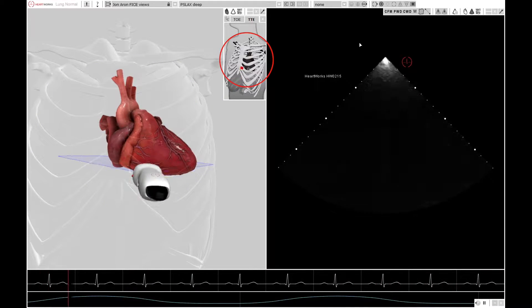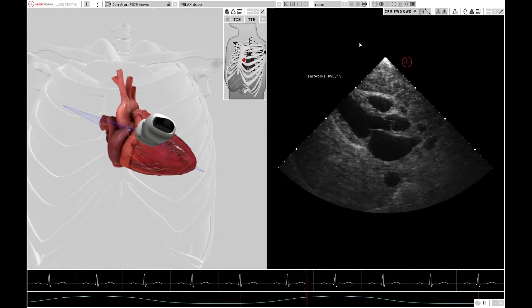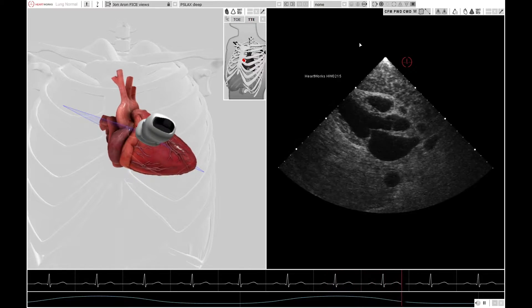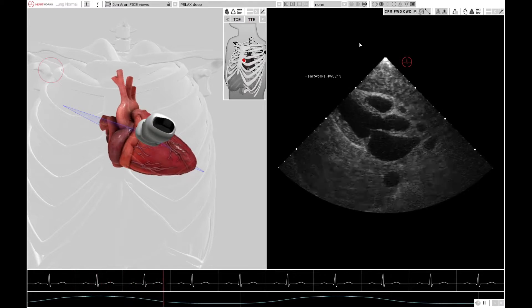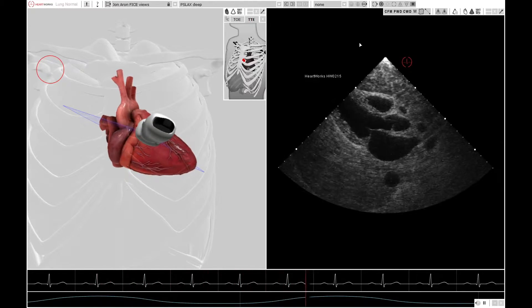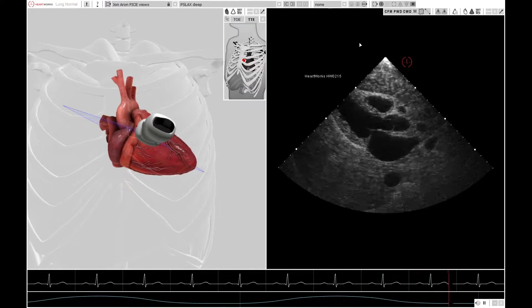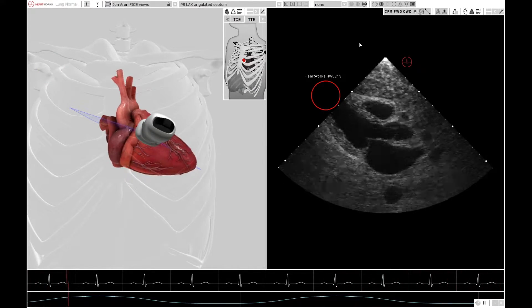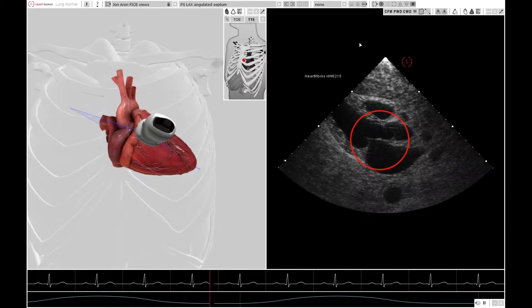The first window you're trying to get is a parasternal window — finding a space between the ribs close to the sternum to get a view of the heart. The first view is a parasternal long axis view with the pointer pointing towards the right shoulder. This gives you the view seen here, with the apex disappearing off to the left and the aortic valve and mitral valve structures being present.